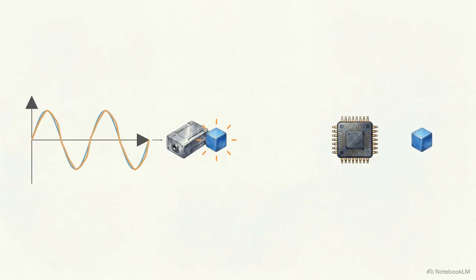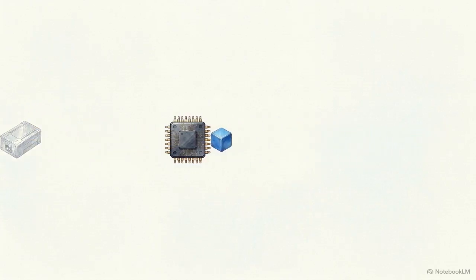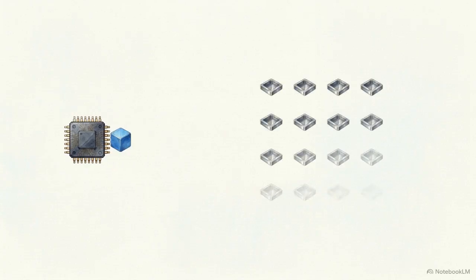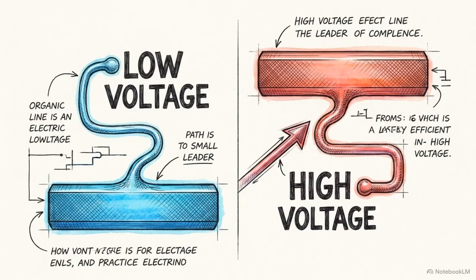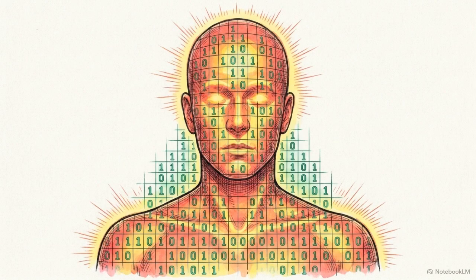The microcontroller grabs these digital blocks and filters them, stripping away erratic electrical noise. Next, it applies calibration corrections. The microcontroller scans a dense grid of pre-programmed mathematical conversion tables, finding the exact coordinate matching the clean digital value. A specific voltage level is assigned 35 degrees Celsius, while another maps to 37 degrees. This precise table lookup process is what finally gives cold binary data its true biological meaning.